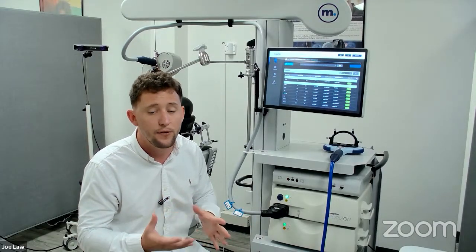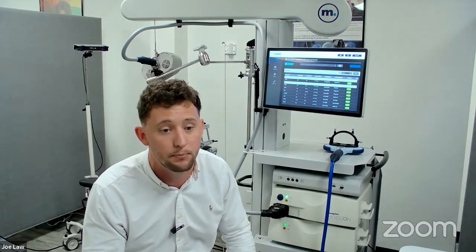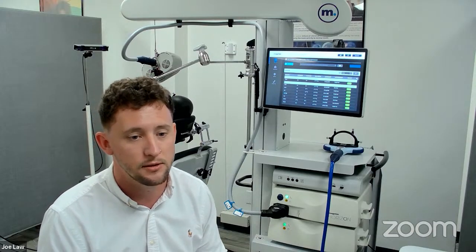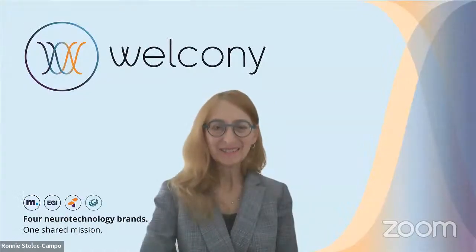We can do firmware updates. We can even guide you whilst you're doing certain protocols, for example. So yeah, fully remote, but we do need authorization from the user just to make sure your system is secure and based with your clinic and not us. Thanks. Great. Thank you, Joe.